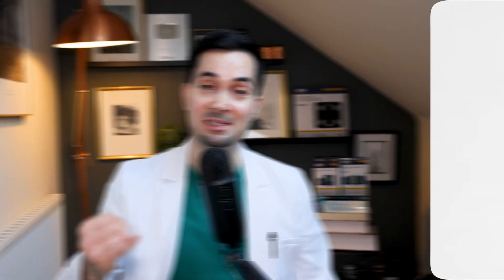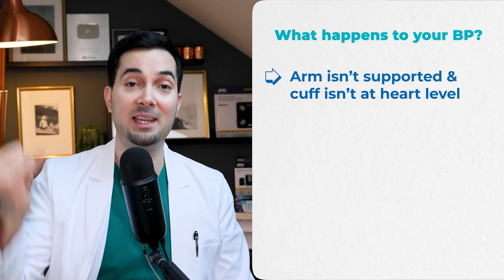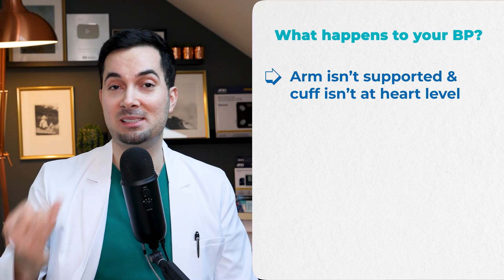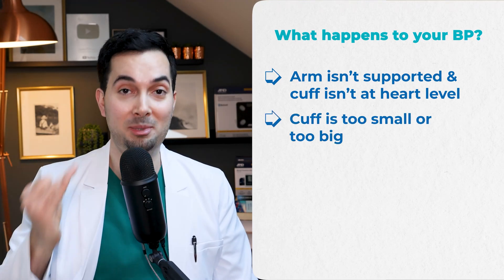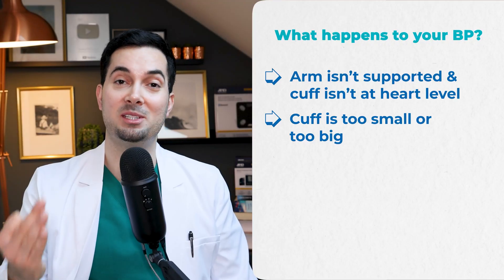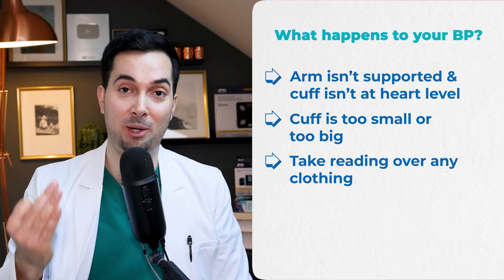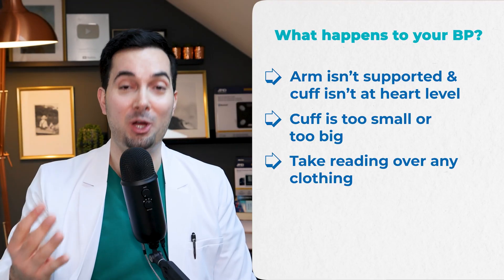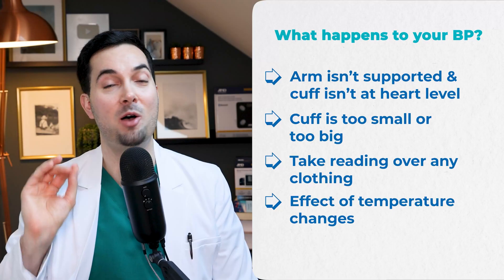So what tests are we going to do? First, we're going to see what happens when your arm isn't supported and the cuff isn't at heart level. Second, we'll see what happens if your cuff is too small or too big. Third, what happens when you take your reading over a jumper or sweater — basically without a bare arm. And fourth, one that a lot of you might not know: we're going to see how temperature affects your blood pressure. I'm really excited for this one. Let's begin.